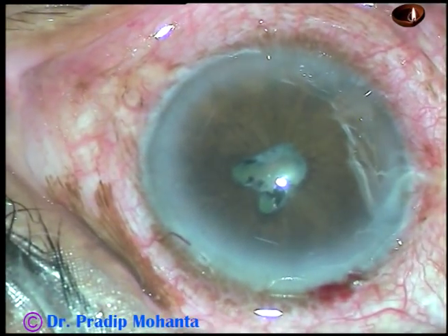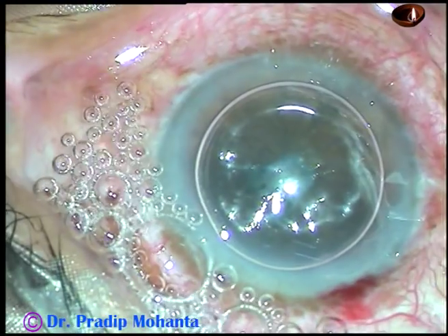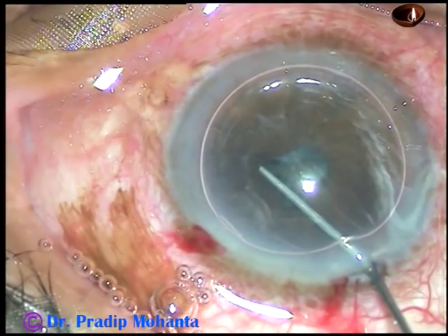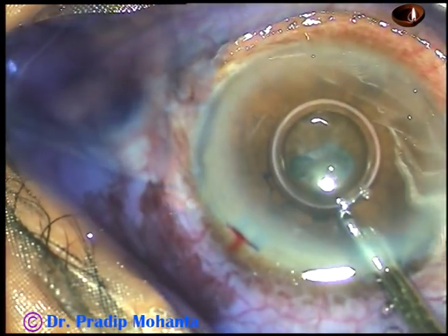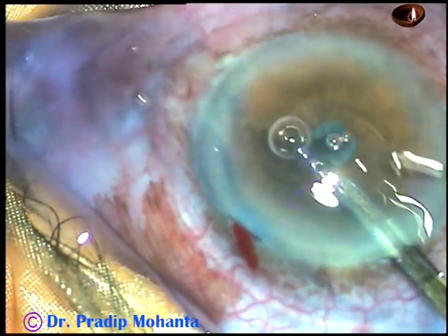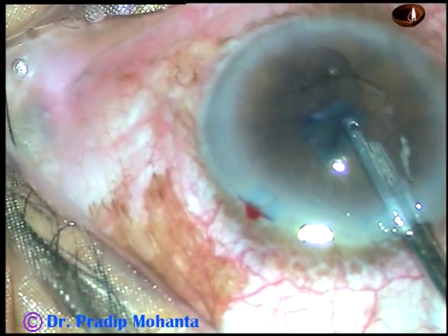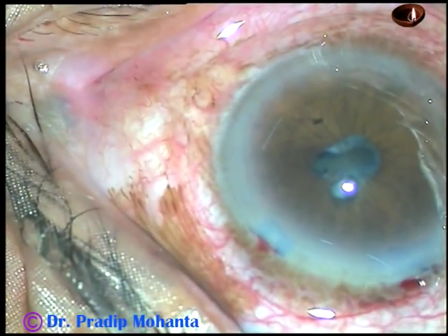This is a severely edited video recording. The surgery took 24 minutes and has been edited to 12 minutes. By this time, the main incision and the paracentesis have been made, and now trypan blue dye is injected in the posterior chamber because if we inject it in the posterior chamber, it will spread all around and all the capsule will be stained. And now the dye is washed out. A lot of dye is there in the posterior chamber; it is coming out gradually and will come out later on during other steps of surgery.